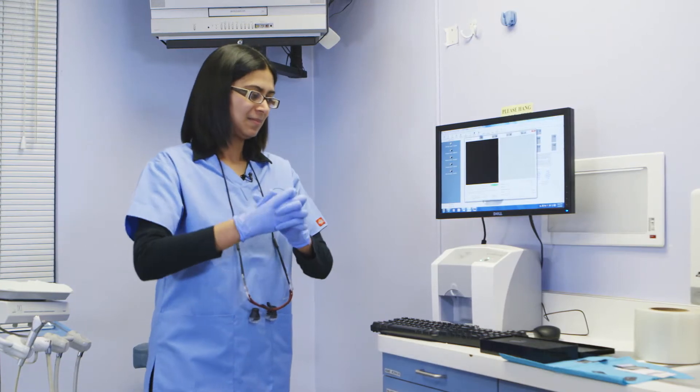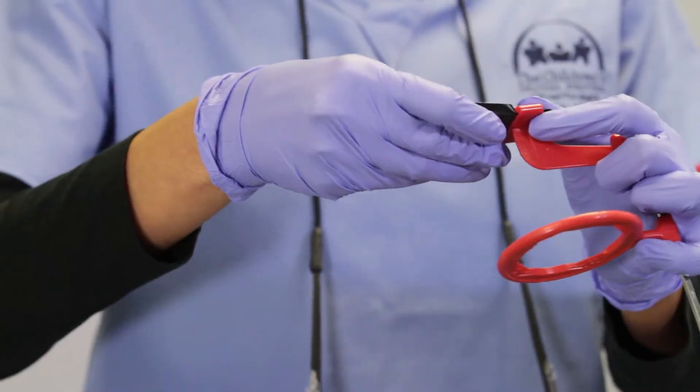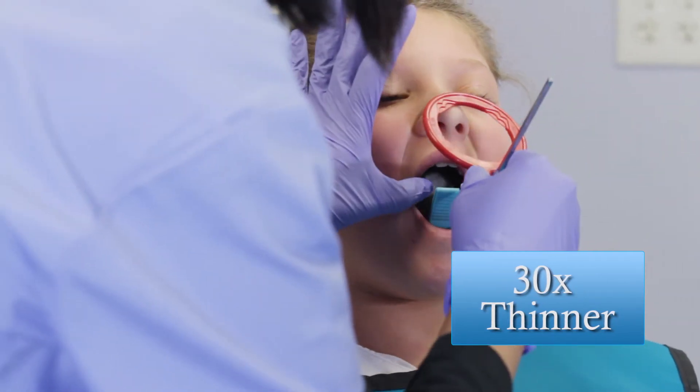I like to use it for all of my patients, my pediatric patients in particular, because the cordless flexible phosphor sensor is 30 times thinner than the digital wired sensor, which makes it very comfortable for the kids to sit down for the x-rays.